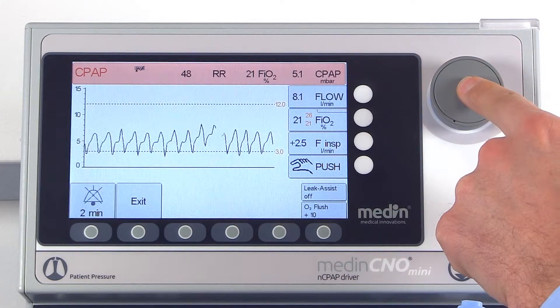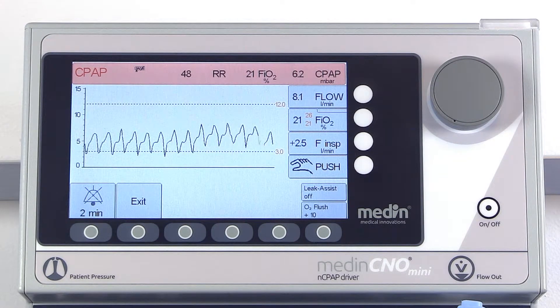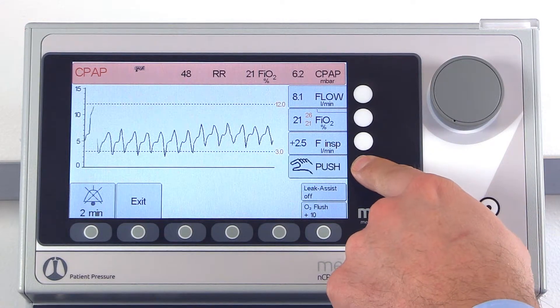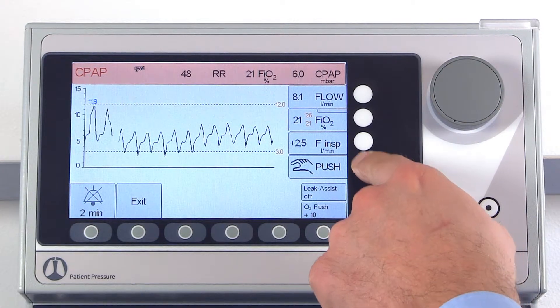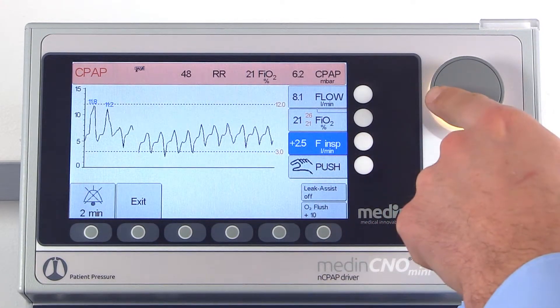You can also apply a manual push flow if needed. The pressure of this push flow can be individually adjusted to meet the baby's specific needs.